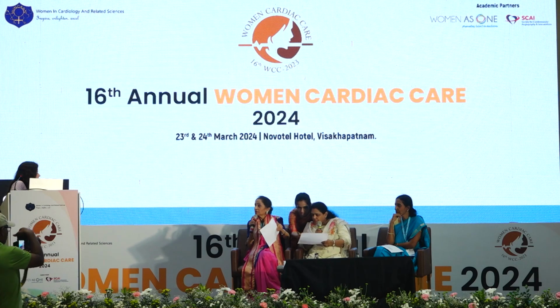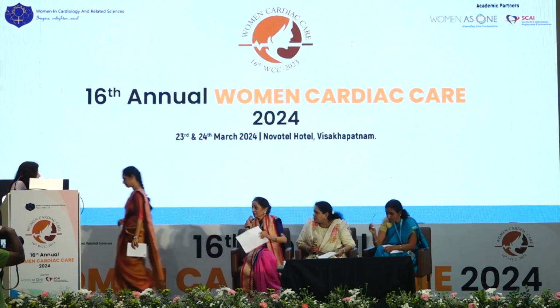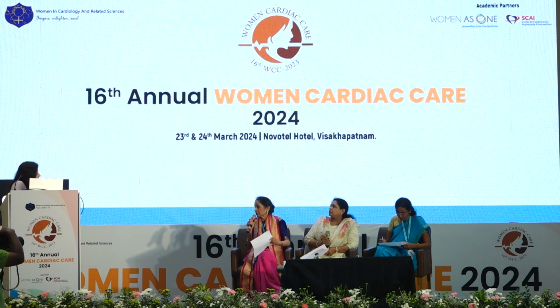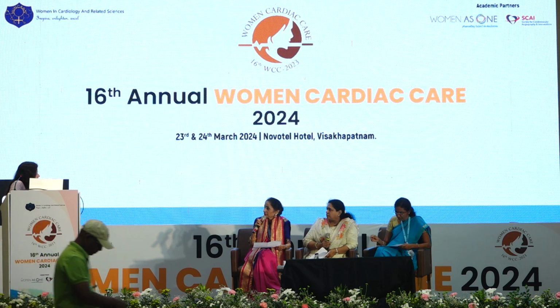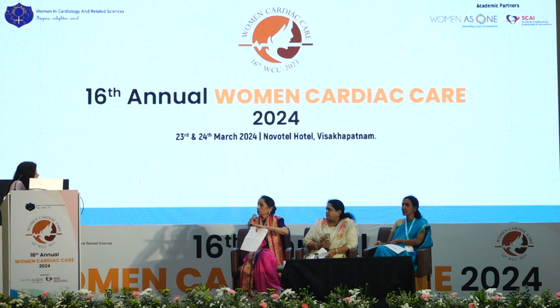When you compare Takayasu's with myocardial bridge, what is the difference in stent fracture? In both conditions, you get the stent fracture. What's the difference? In Takayasu, it occurs earlier. As soon as you put the stent, it fractures because it's fibrous and it doesn't yield. You are using force to open up the stent and the fibrous tissue is not allowing it. So it is like a tug of war between the two anatomies.